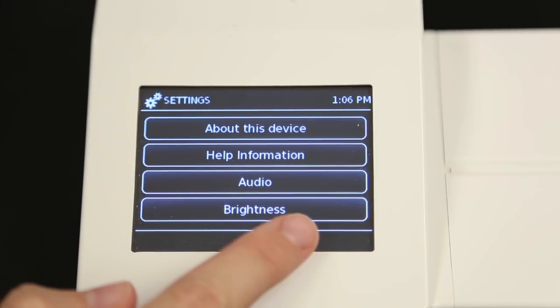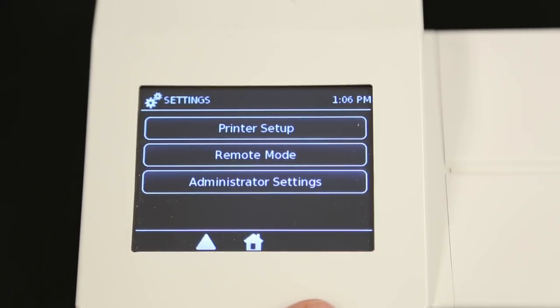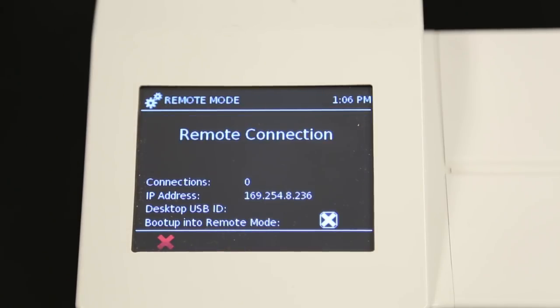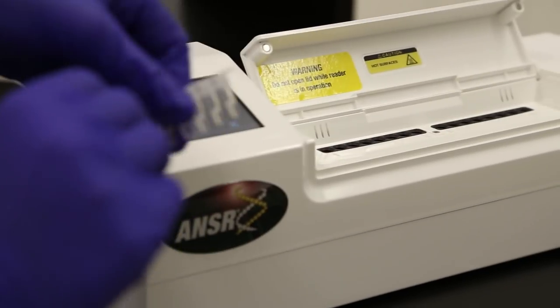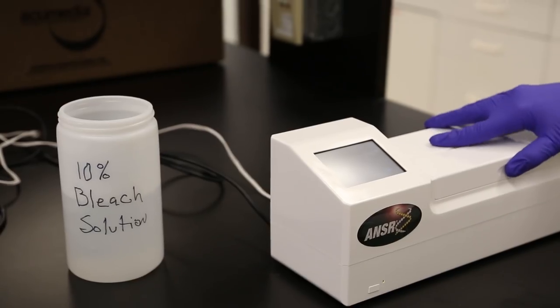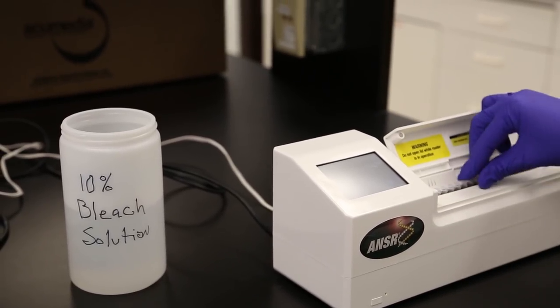Then press the down arrow once at the bottom of the screen. From here, select Remote Mode, which is the second box down. The screen will say Remote Connection. Note, the reader's lid should remain closed except for placing reaction tubes in or taking them out of the reader.